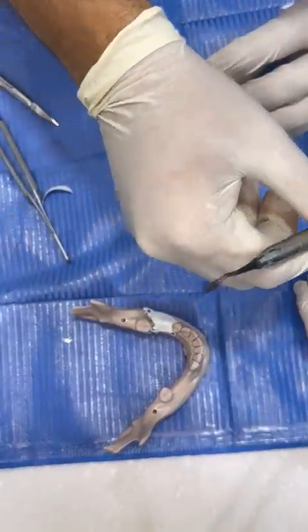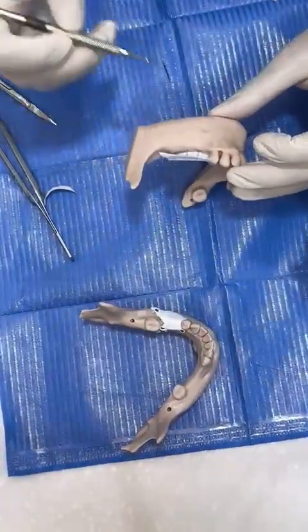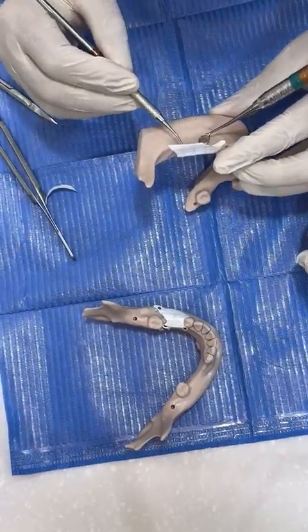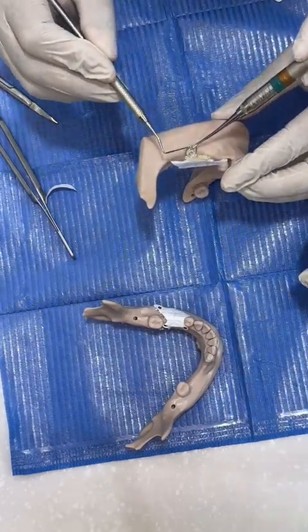Give me one graft. It's here. Yes. Use this. Give me the graft here, please. Put the graft here. Okay. Yes. Very good. More. I need more. Is it clear? Okay.